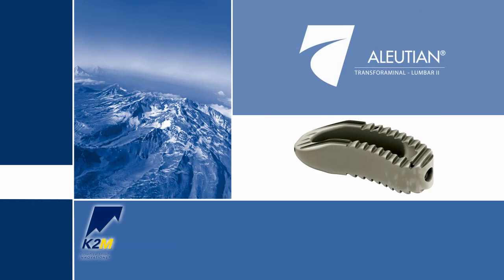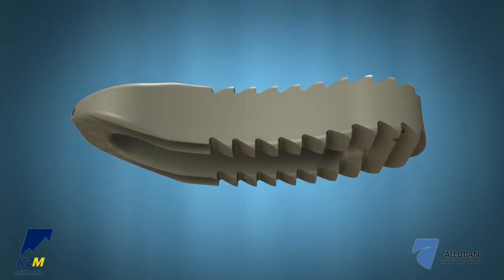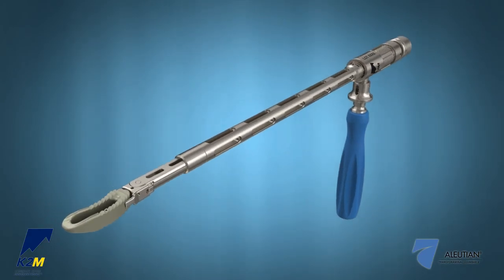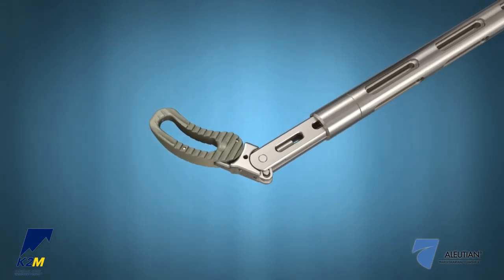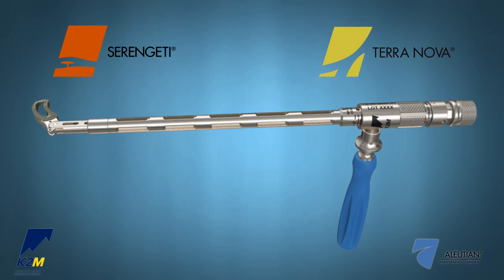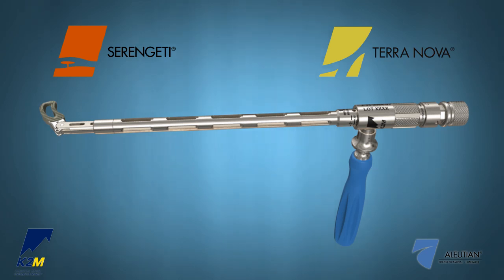Introducing the ALEUTIAN Transforaminal Lumbar TLIF II Interbody System from K2M, Complex Spine Innovations. The ALEUTIAN TLIF II System offers a full range of bulleted PEEK interbody devices, disc preparation instruments, and innovative insertion options, including an adjustable inserter which allows for variable angulation of the implant from 0 degrees to 60 degrees in situ. When used with the Serengeti Minimally Invasive Retractor System and the TerraNova Minimally Invasive Access System, the ALEUTIAN TLIF II Interbody System is designed to facilitate a minimally invasive transforaminal surgical approach for lumbar interbody fusion.